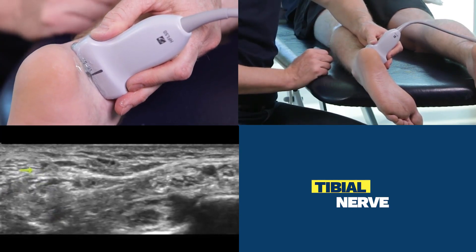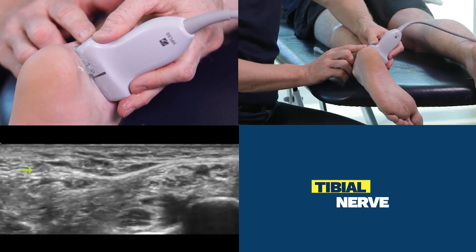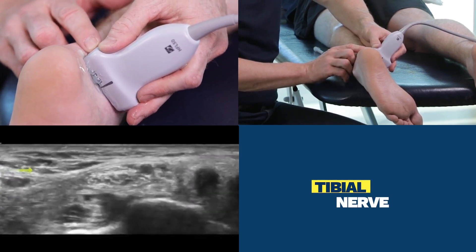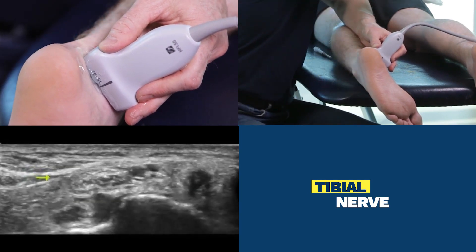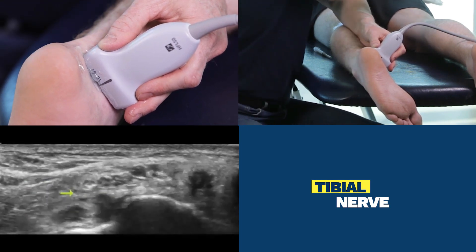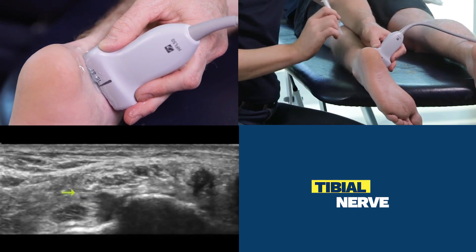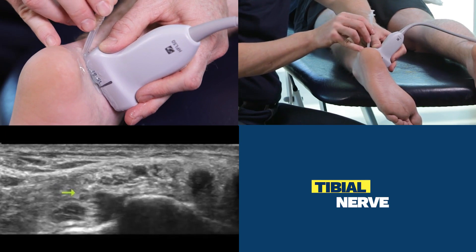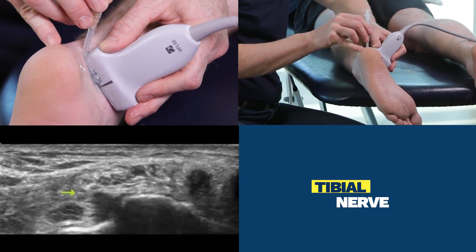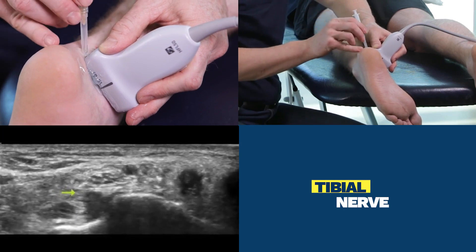To return to the tibial nerve — if I were to do an injection, I would move the probe away from the Achilles tendon and put the tibial nerve in the center of the screen. I want to put my needle either just deep to it or superficial; my preference would be to go deep to it. My needle entry will be at about a 30 to 45 degree angle, touching the tip of the yellow arrow here.